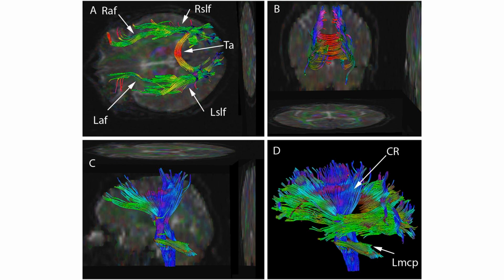Diffusion MRI, a method to produce images of the molecular diffusion process in tissues, was introduced in 1985, notably for its potential for neuroimaging. An improvement of diffusion MRI, called diffusion tensor MRI or DTI, allows to fully characterize molecular diffusion in the 3 dimensions of space.